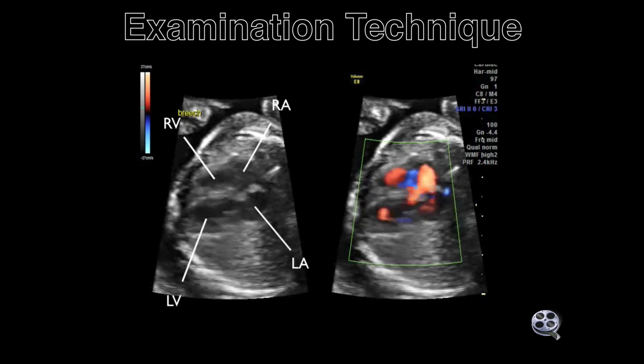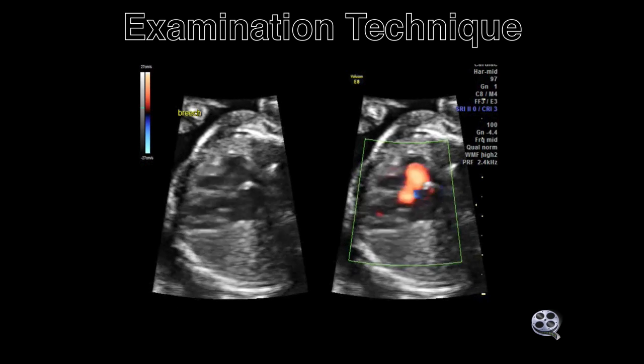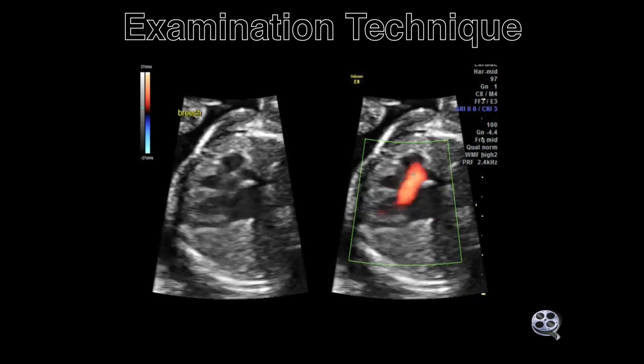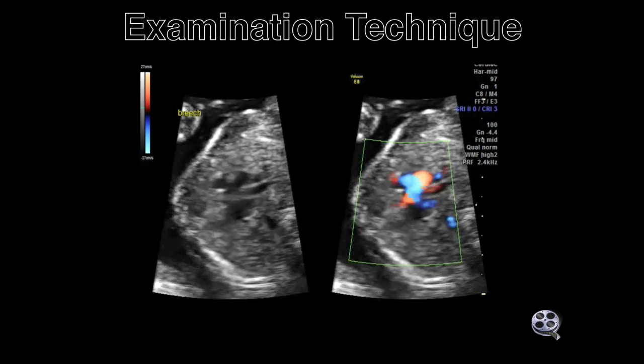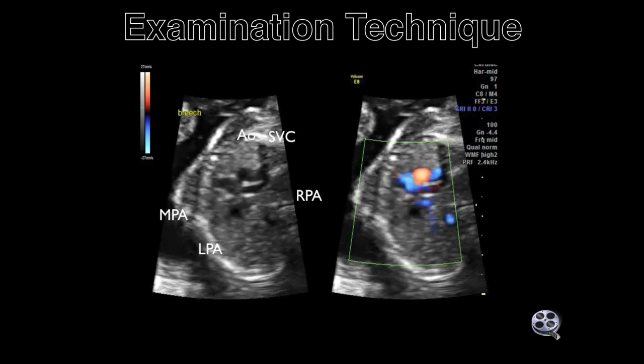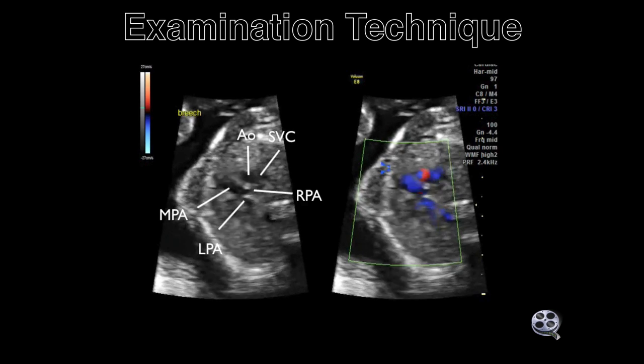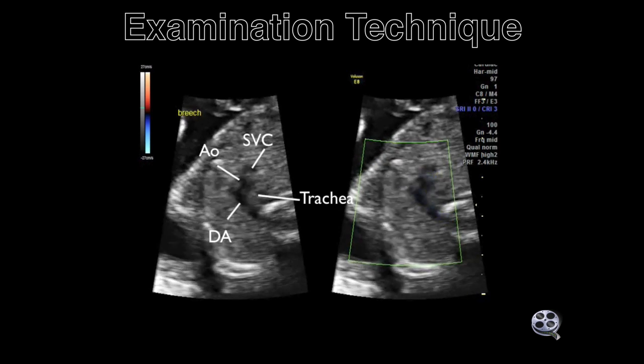This is a transverse sweep with the fetus in the breech position. The simultaneous images demonstrate the B-mode on the left and the power Doppler on the right.